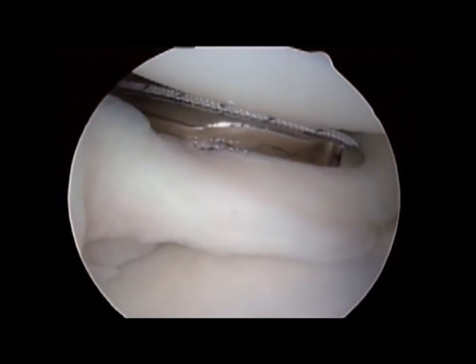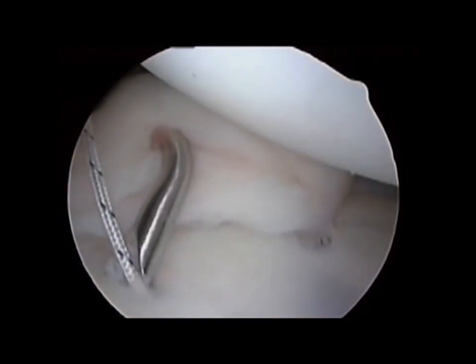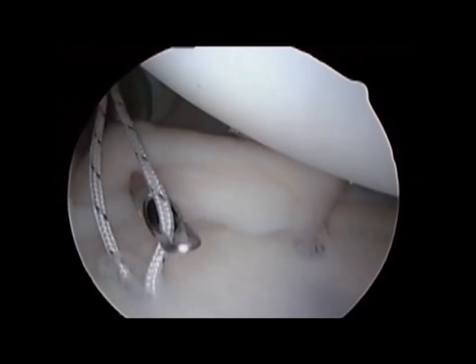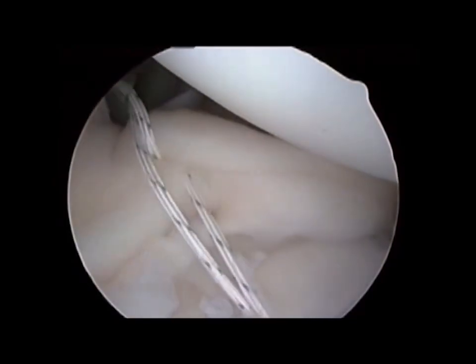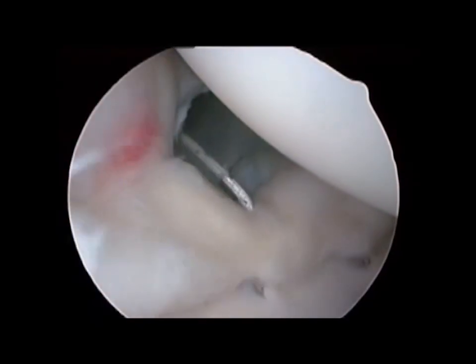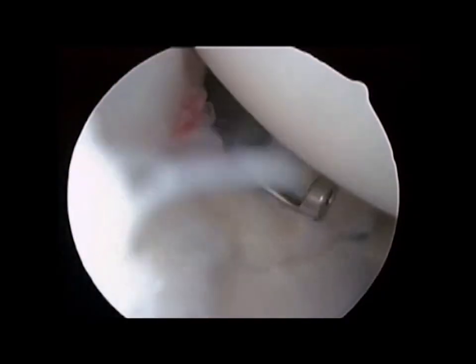and this even allows for a bumper effect to be achieved while avoiding the labrum altogether. We can see a posterior inferior labral placement. We can see a more posterior placement. And again, note the bumper that's achieved with this labral sparing capsulorrhaphy.